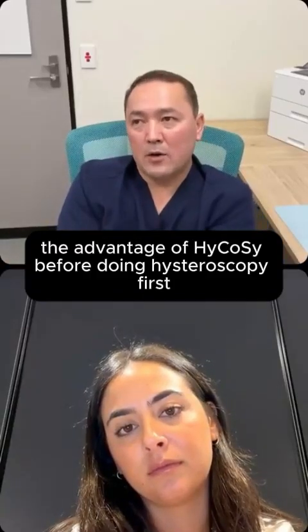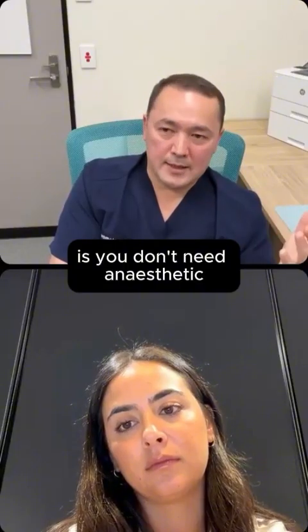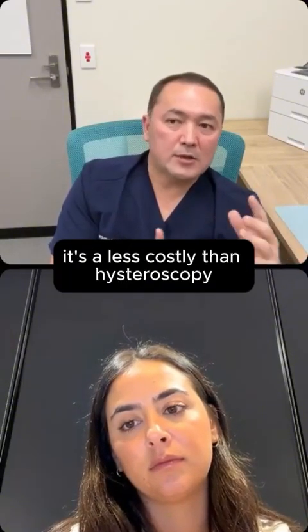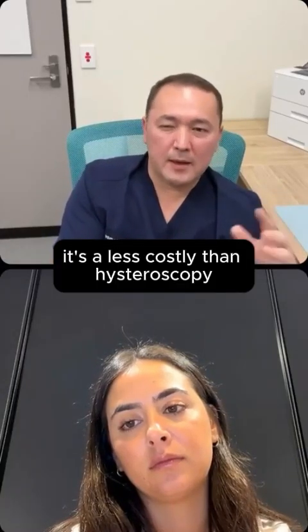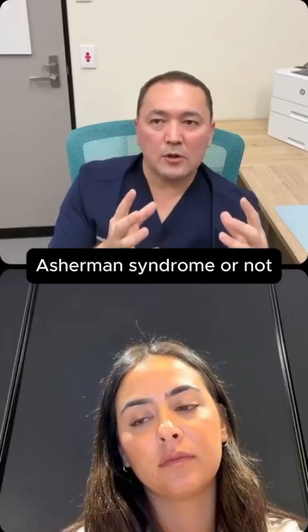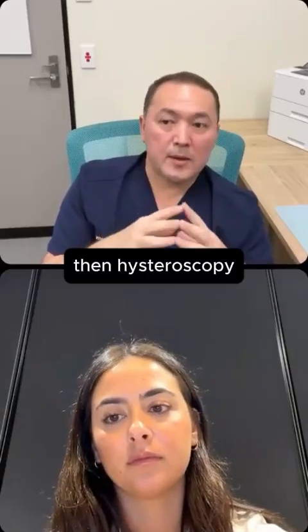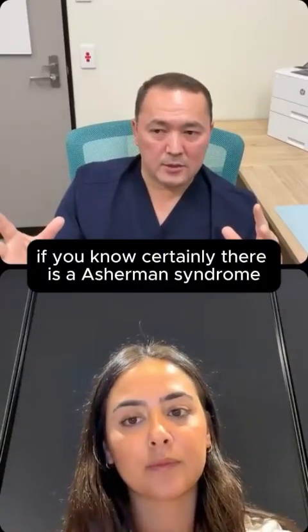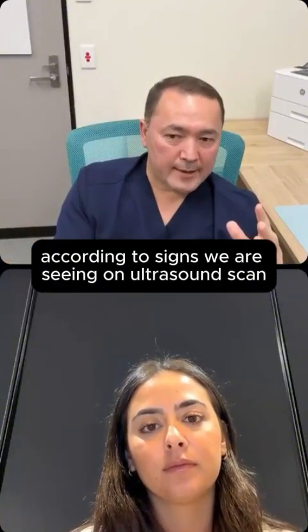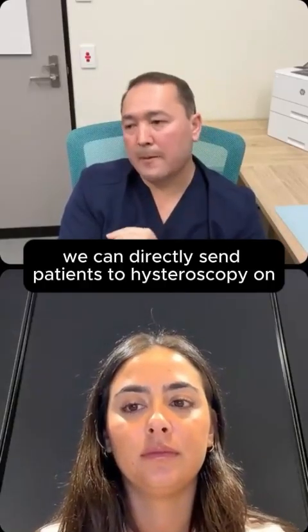The advantage of HyCoSy before hysteroscopy is you don't need anesthetic, it's less invasive, and it's less costly. If you're not quite sure whether there is Asherman syndrome or not, we normally request HyCoSy first. If diagnosed, then hysteroscopy. If we know certainly there is Asherman syndrome according to history and what we are seeing on the ultrasound scan, we can directly send patients to hysteroscopy.